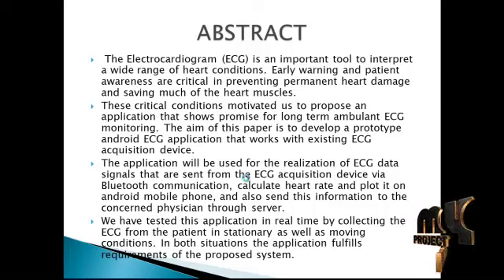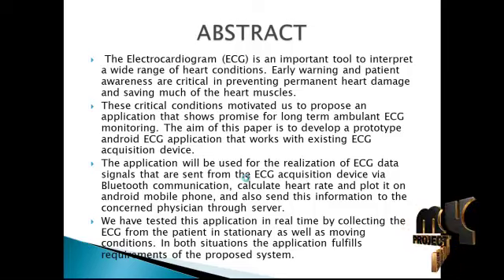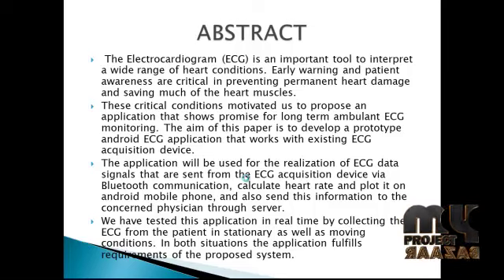This Android application is developed in the Android operating system. This will act as a graphical user interface of the system. The user can easily interact with the system. Data from the ECG sensing hardware can be shown in graphics with a smartphone application. The ECG app framework is used to easily integrate this application with any other Android phones.